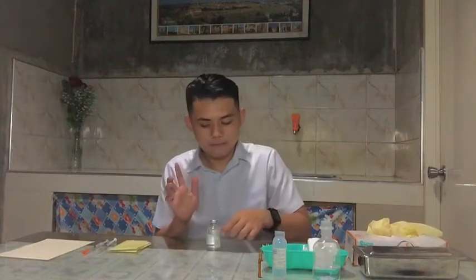So next is preparing medication for the intramuscular route. Prepare the medication ampule for drug withdrawal. Flick the upper stem of the ampule several times with a fingernail. By flicking, this will cause the air bubbles to rise.